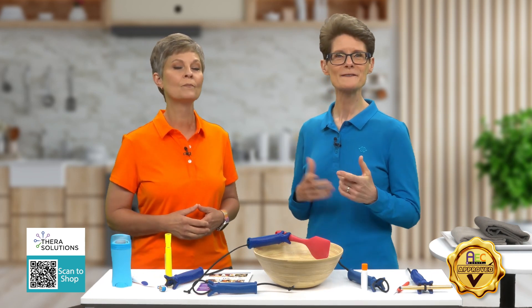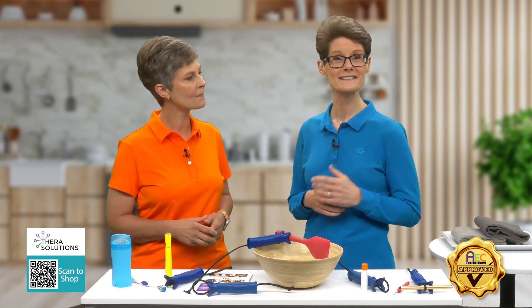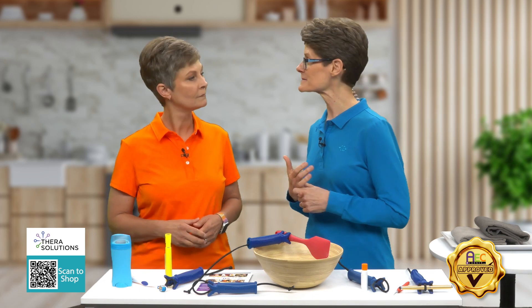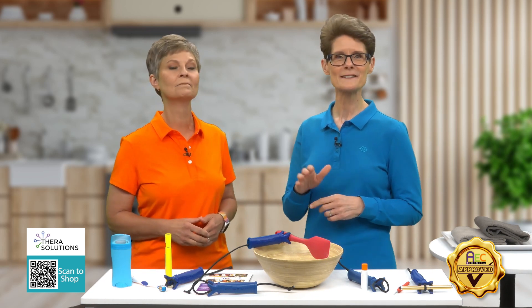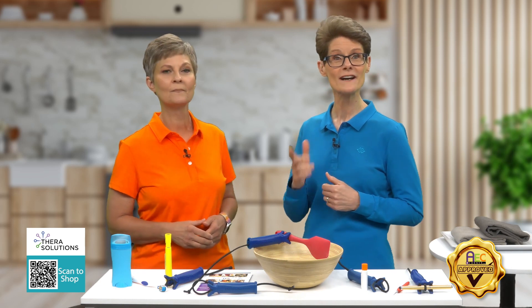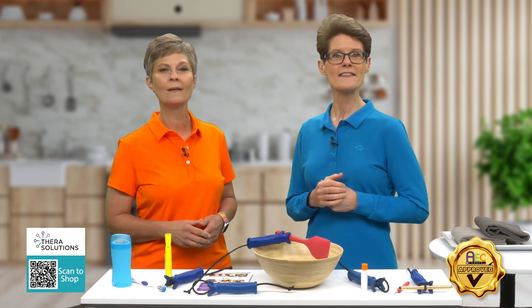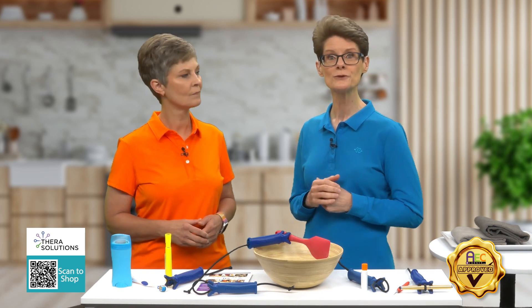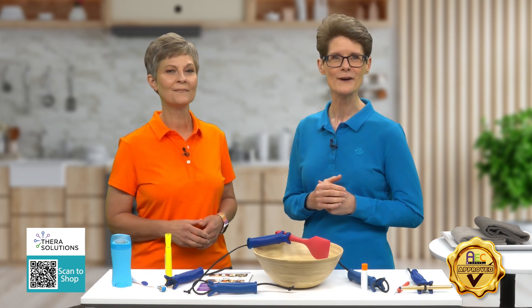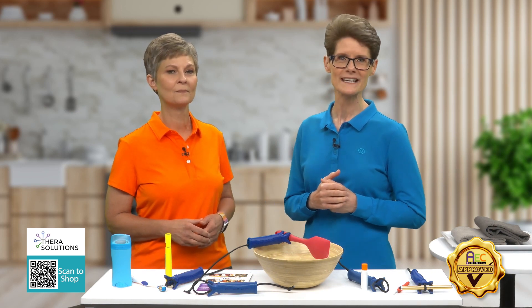That is so true. We found this product called the Functional Hand, which was created by occupational therapist Linda Mary and physical therapist Celine Skirtich. These therapists have over 40 years of experience working with patients who have various diagnoses resulting in grasping difficulties. They realized there was no single tool on the market that could hold a variety of objects of varying sizes to complete meaningful everyday tasks.